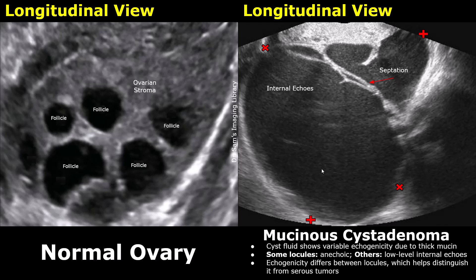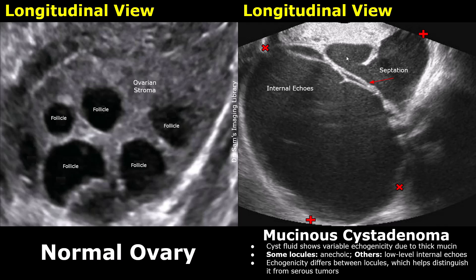Some locules contain more watery or less concentrated mucin, allowing ultrasound waves to pass through freely. These locules appear anechoic, meaning they look black on ultrasound, similar to simple fluid. Other locules contain thicker, more protein-rich or gelatinous mucin. This denser material causes partial reflection and scattering of ultrasound waves, resulting in low-level internal echoes, which appear gray rather than black.